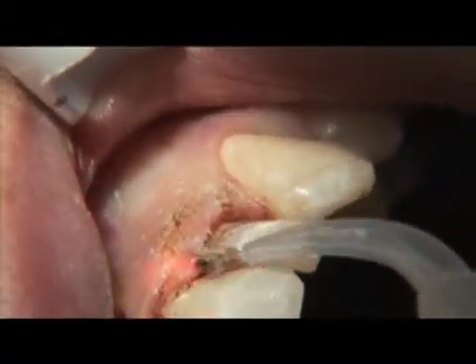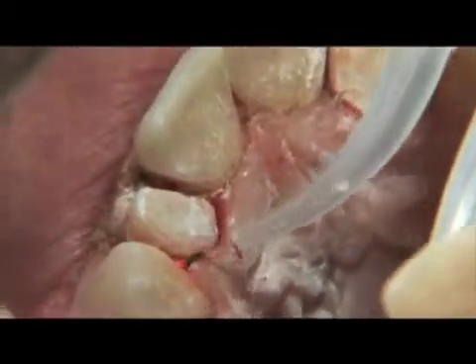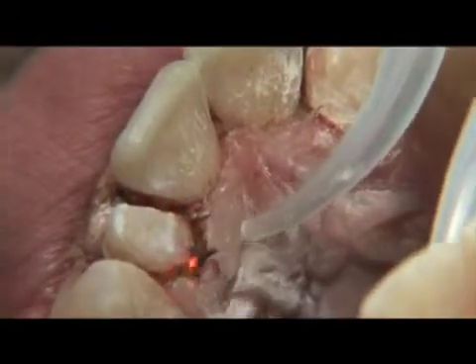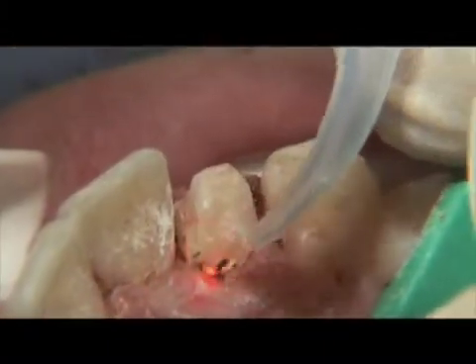Always keep the tip moving and periodically stop to remove the residue that accumulated on the fiber tip. After completing tooth preparation, you are now ready to start with the tissue troughing. At the same time, the laser will coagulate any bleeding that occurs around the tooth.